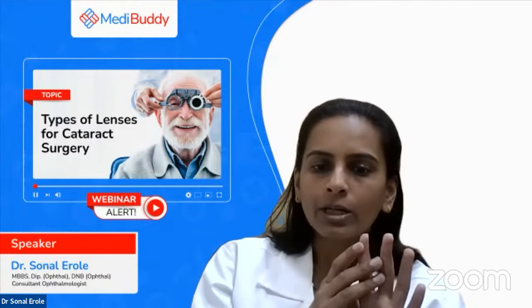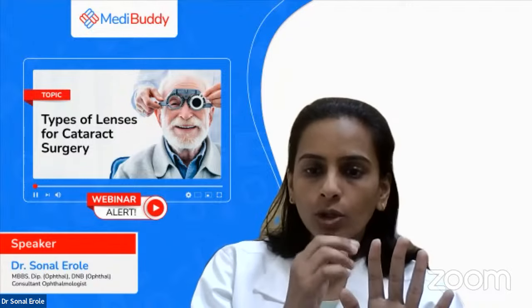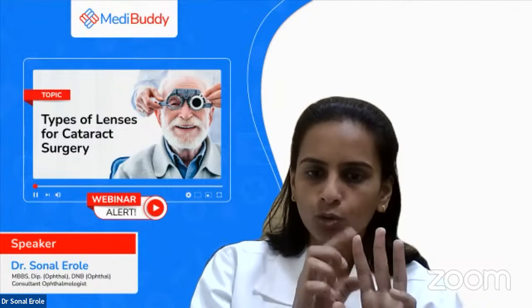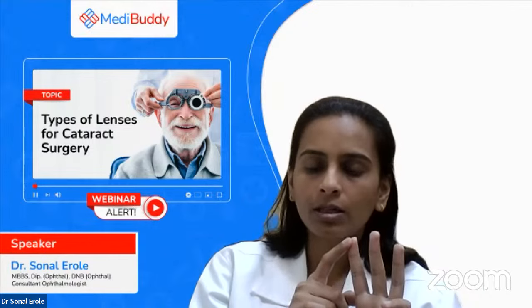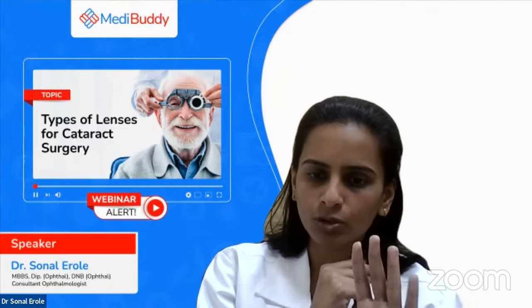And practical and moderately priced lenses, as I already told, particularly depend on the patient's budget, the patient's capacity, and the patient's needs basically. So if you want to have a very good lens, then you can definitely go for a very good lens. And also it depends on the retina condition or the other conditions of the eye.